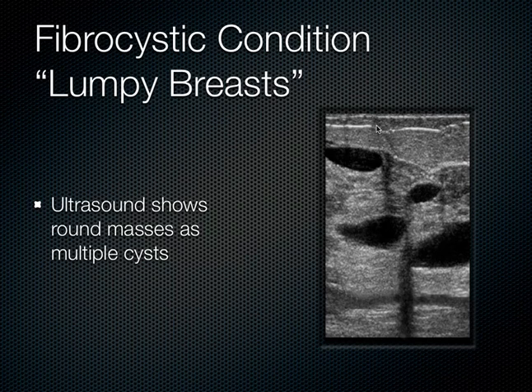The sound is going through the skin and then into this glandular tissue here, and it reaches this cystic structure, and then the sound is redirected. And so it goes through here, and then it gets redirected. And on the edges of that cystic structure, we get these lateral shadows. Sometimes we call it lateral cystic shadowing, or refraction artifact. The sound is being redirected. So that's why we see these shadows here on the edges of these cystic structures.